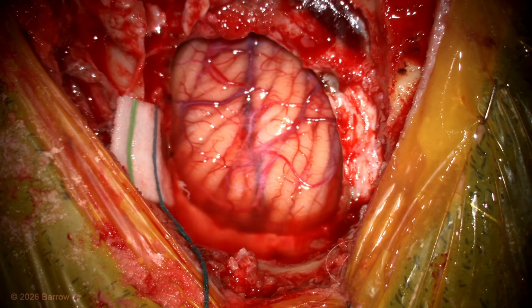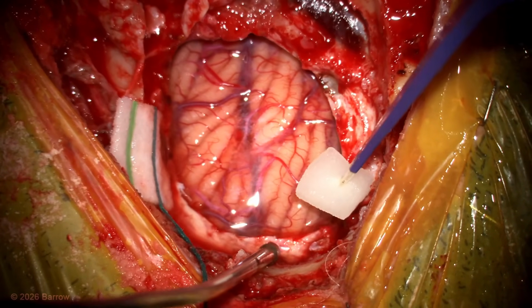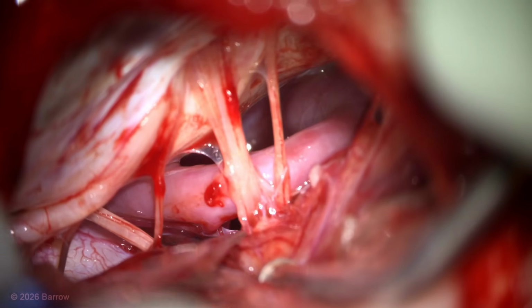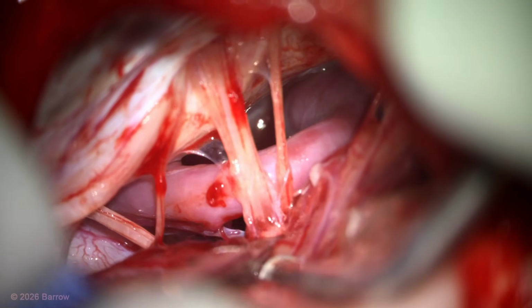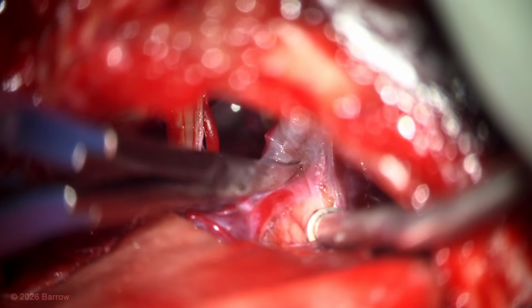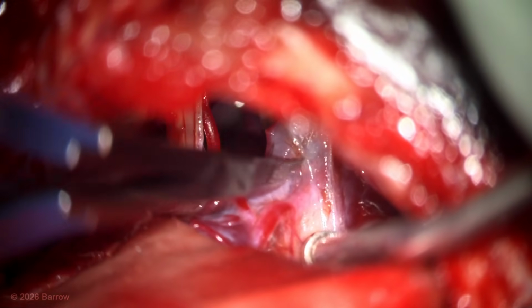Here's an overview of the surgical exposure. The top of the head is to your right, the feet are to your left, and the sigmoid sinus is at the top of your screen. Here is a view into the cerebellopontine angle cistern, where I'm dissecting the 9th and 10th nerves away from the cerebellum. The arachnoid of the cerebellopontine angle cistern is opened further around the 7th and 8th nerves.